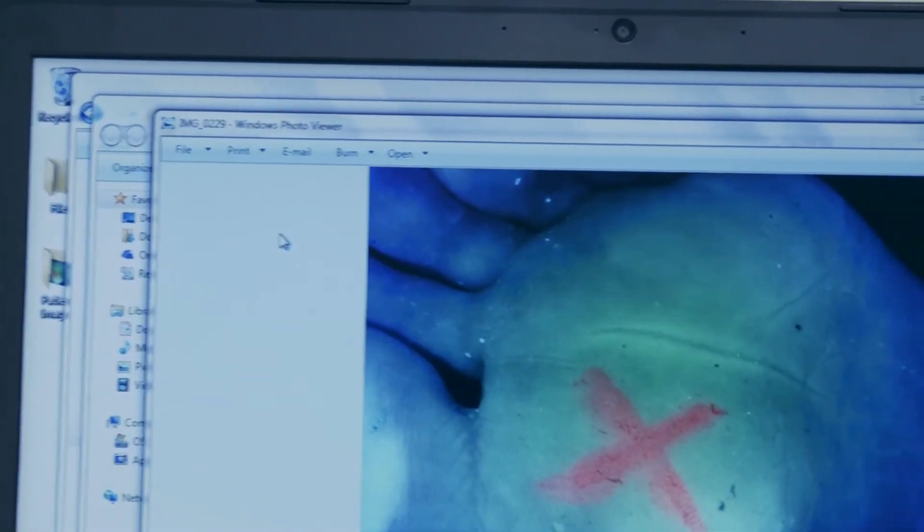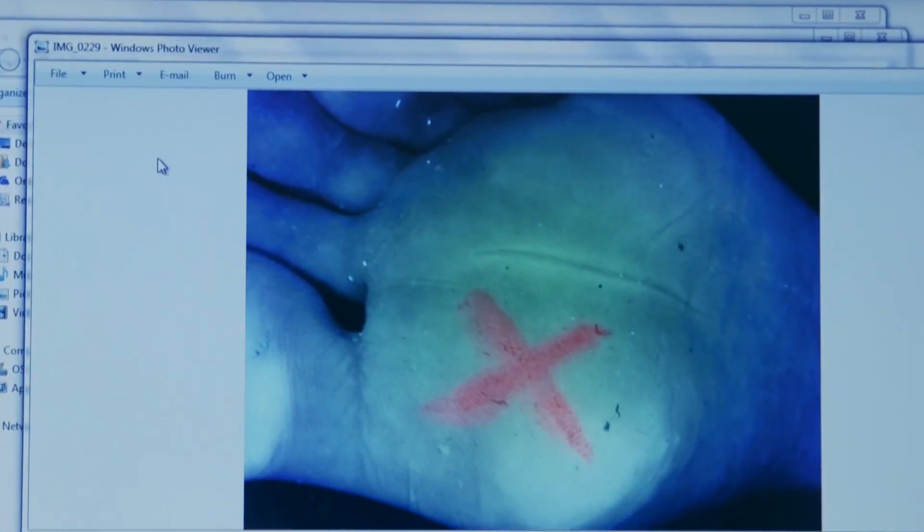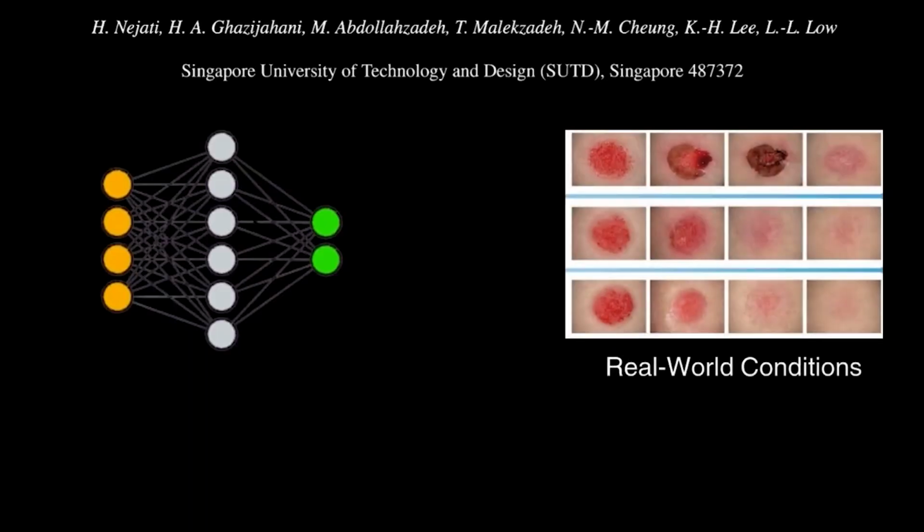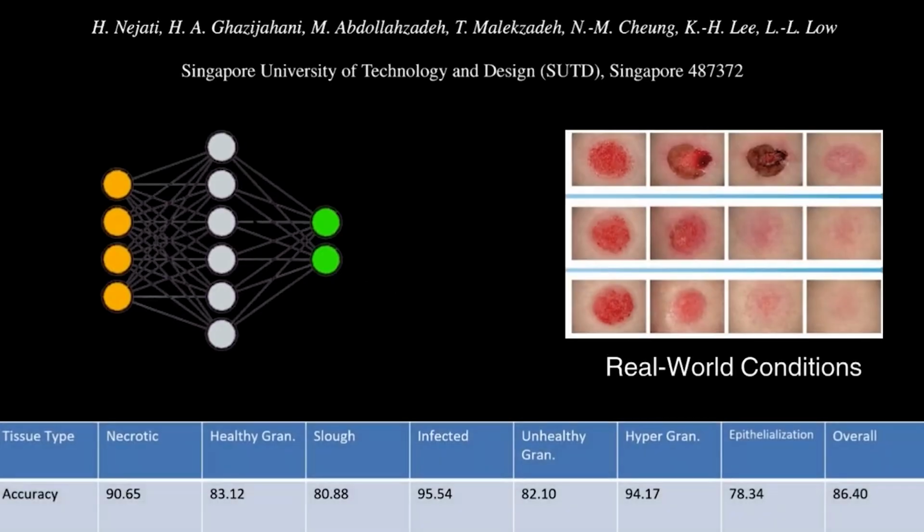The software then generates a report, so it might say something like, wound size is 4.2 by 3.1 centimeters, the tissue composition is 75% granulation, 5% eschar, surrounding skin is intact, with mild redness. The change from last assessment is a 10% decrease in size, and a 5% increase in granulation. This report is saved in the system. You can see the healing curves and you can spot when a wound stops improving. You can catch deterioration early.